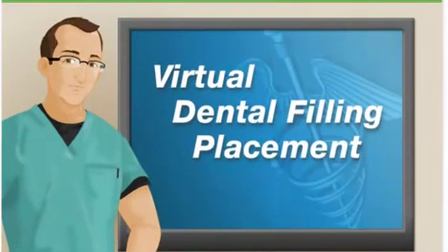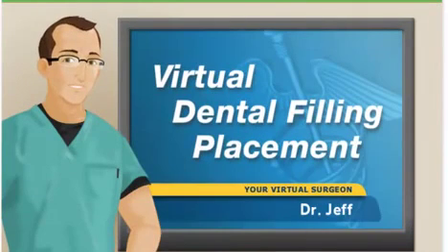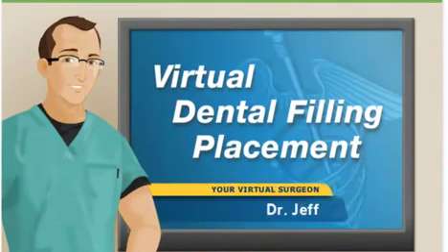Surgery Squad's virtual dental filling placement. I'm Dr. Jeff, and I'll be guiding you through this procedure today.